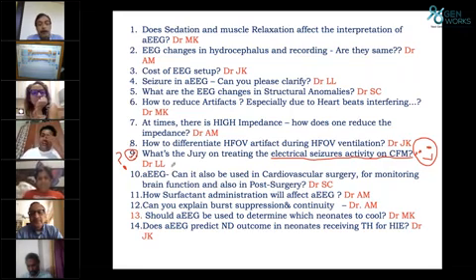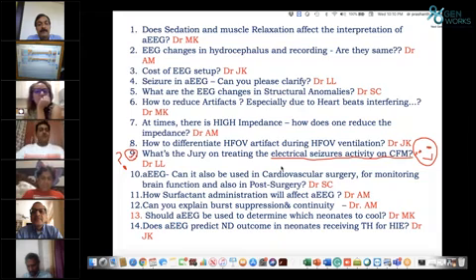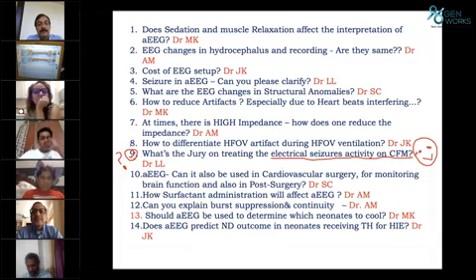Dinkar sir, initially when we had this machine at Bidri Hospital, we were fascinated by that orange color. Every time we said orange color, our sister used to say, sir, seizure is coming, we have to load it. One fine day, we usually come across babies whose Apgars are less than 3, as rightly said by Jury madam. 1 minute Apgar will be 1, at 5 minutes it will be less than 3 or 4. Such babies take around 3 to 4 hours to come to us. By then the heart rate will be less than 60, saturation 60 to 70. We end up ventilating them. The child will be continuously seizing. Once we load with phenobarb, they settle down.